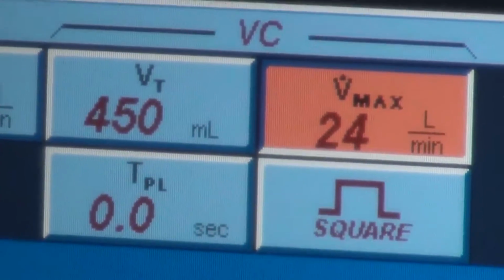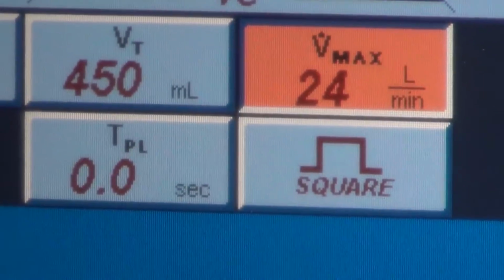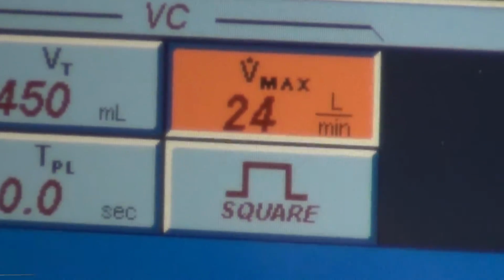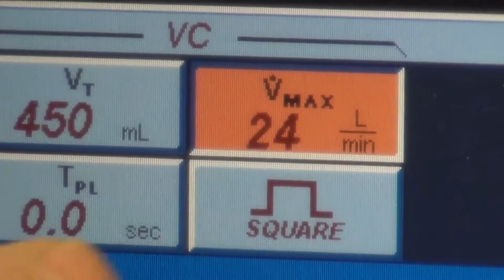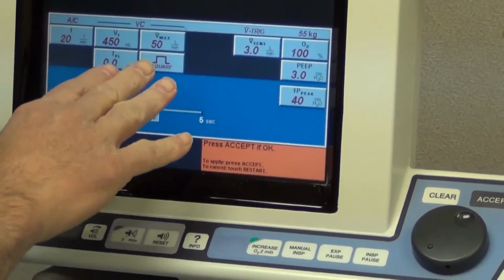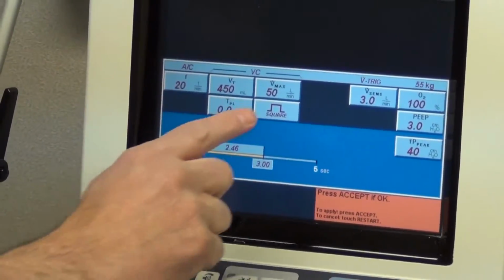And our max flow, this is how quickly the patient can take a breath. The machine limits. Oh, okay. So the max flow, like I said earlier, we're just going to give you a flat number, anywhere from 50 to 60. So for our purposes, this will fit most patients' need for flow as they take a breath. So we're going to go ahead and hit 50. Notice I did not hit accept. If you do, it will transfer it up here and it'll be set, and you'll have to make the changes up here, which I'll demonstrate here in a second.